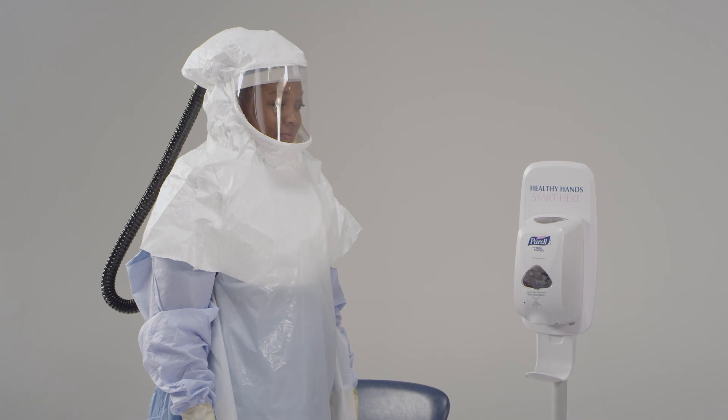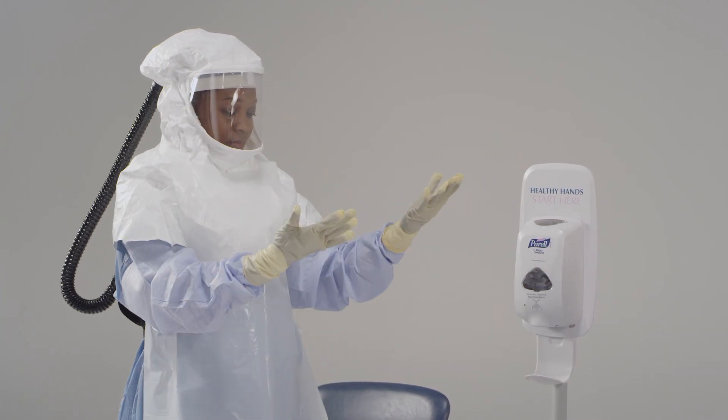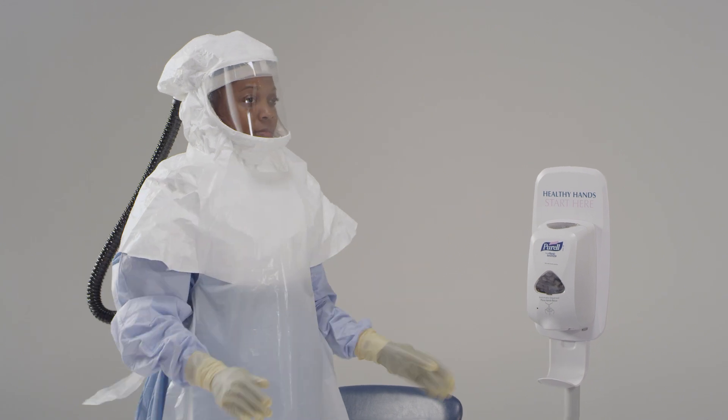I'm here to help you through the doffing process. You'll hear me give directions that are not part of standard practice but are designed to keep you safe. We need to check for any rips, tears, or contaminants on your clothes. Remember to go slowly and be careful not to touch your face. As you remove each item, it is important to place it immediately in the designated waste receptacle.